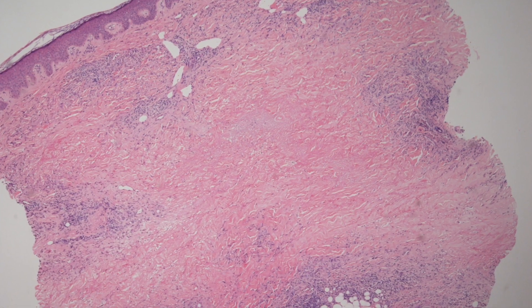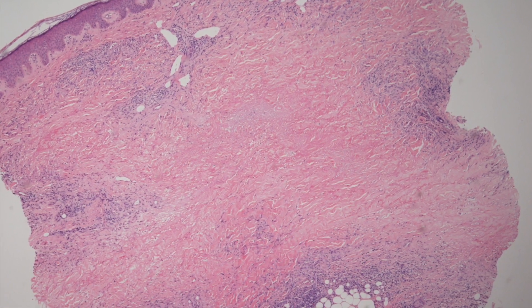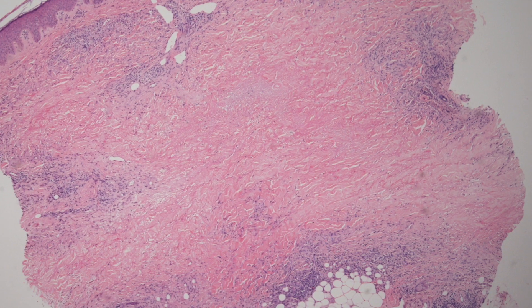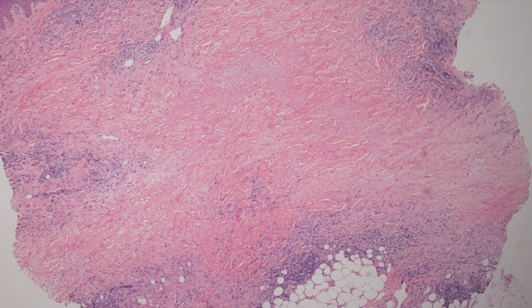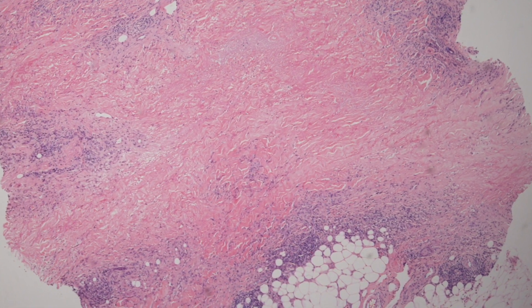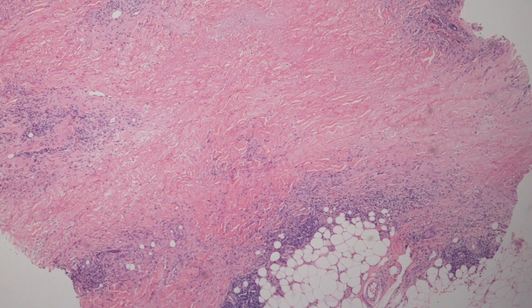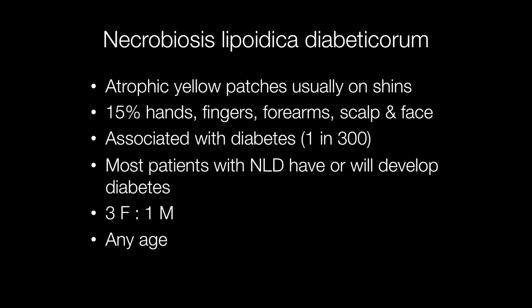This is the low-power histology of NLD, or Necrobiosis Lipoidica Diabeticorum. Classically, NLD presents with atrophic yellow patches usually on the shins, although in around 15% of cases areas affected can include the hands, fingers, forearms, scalp and face.